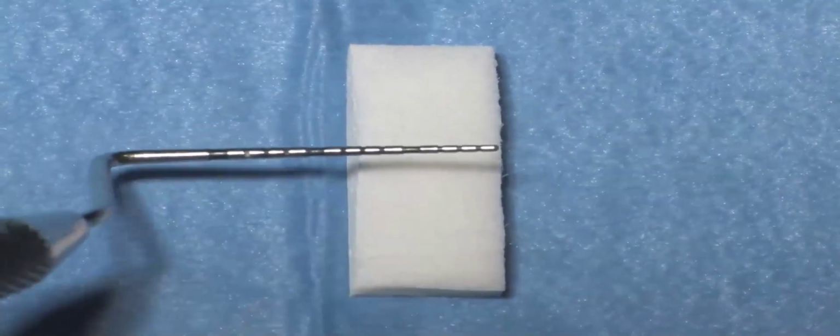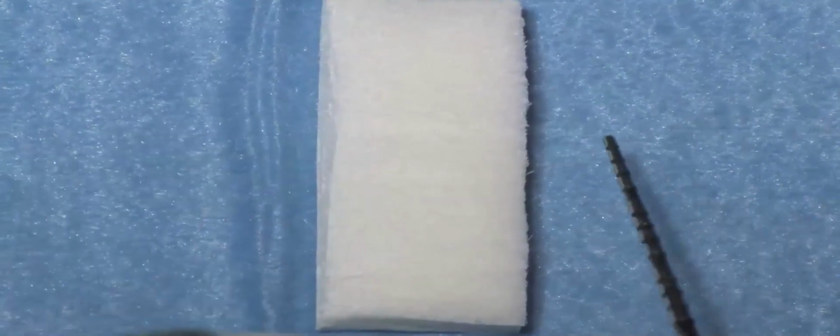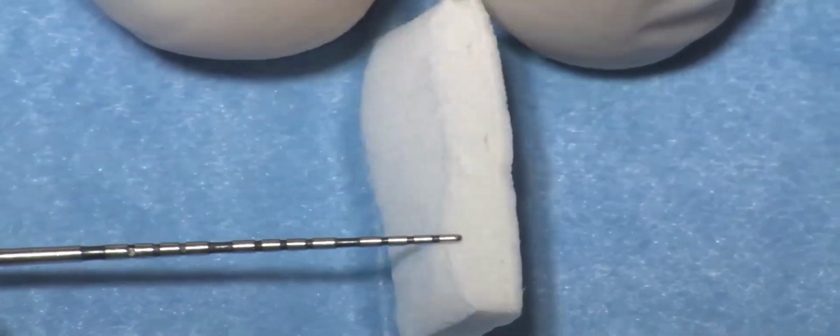We said about 18 millimeters for about 7, 8. You see that the thickness of the material is very, very important when it's dry. It's more than 3 millimeters. In this situation, it's quite difficult to be sutured.